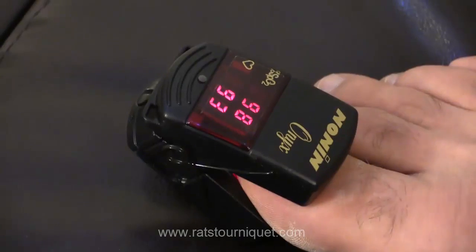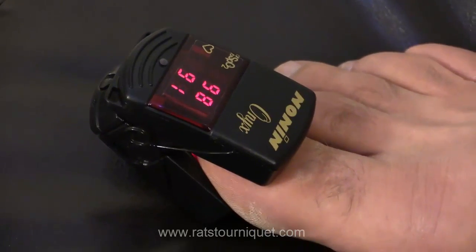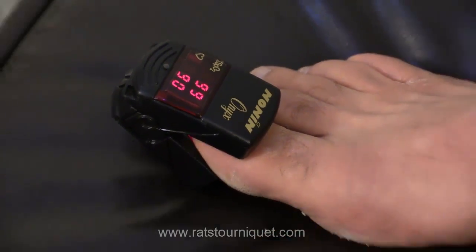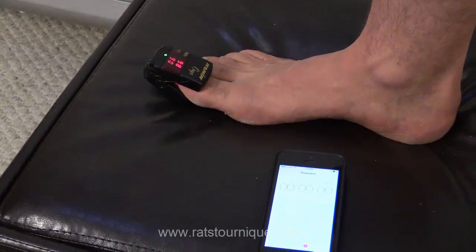Today I'm going to be demonstrating the proper use on my own thigh, which is 26 inches, well above the average in size. On my toe you can see we have a Pulse Ox, and we have a stopwatch so that we can monitor how fast we can shut down the pulse to the end of my foot.